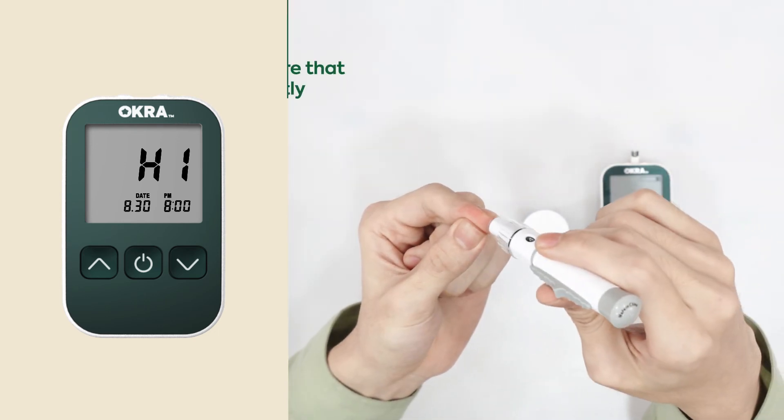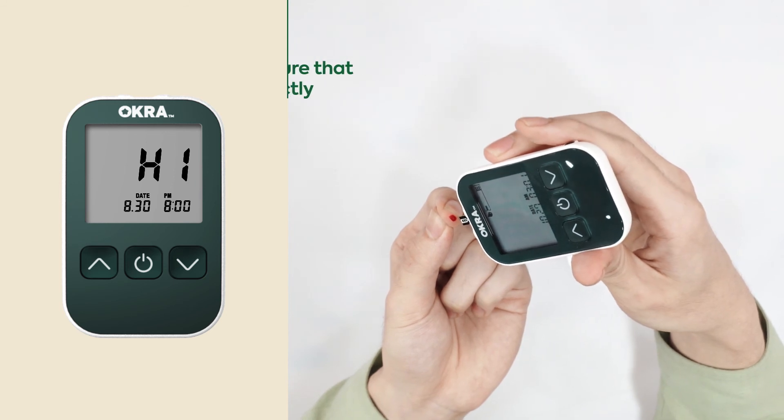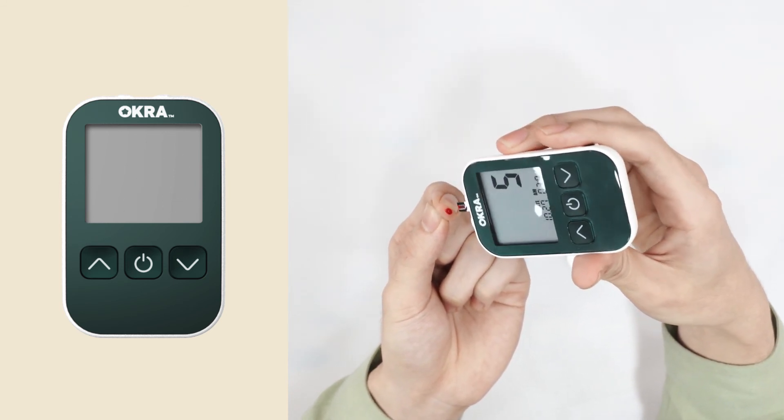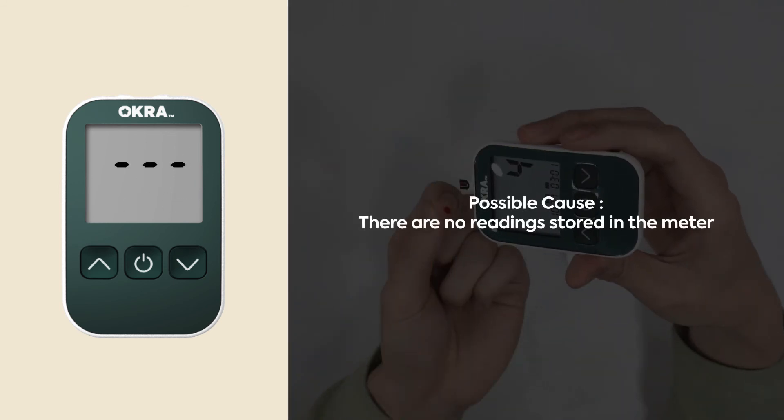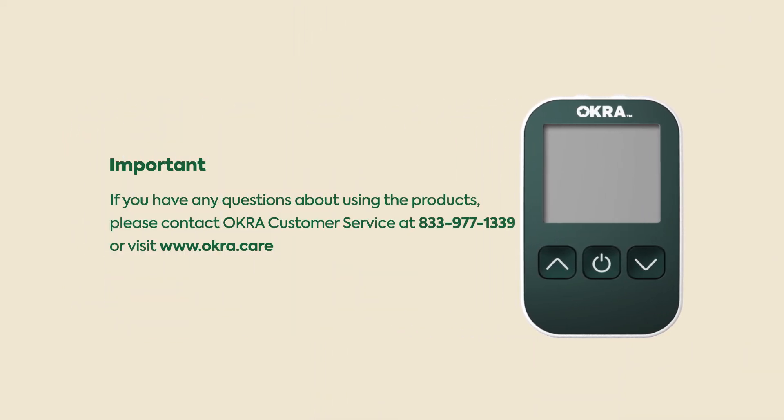The test should be repeated to ensure that the test procedure was done correctly. There are no readings stored in the meter. If you have any questions about using the products, please contact Okra customer service at 833-977-1339 or visit www.okra.care.